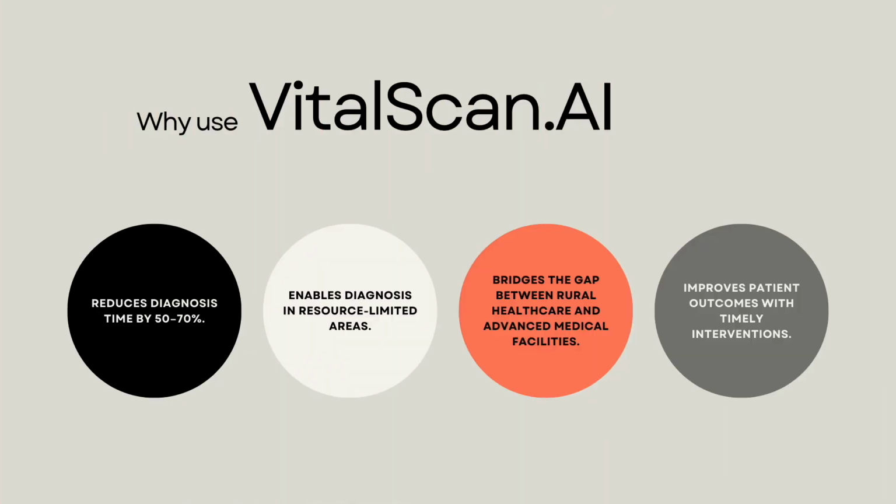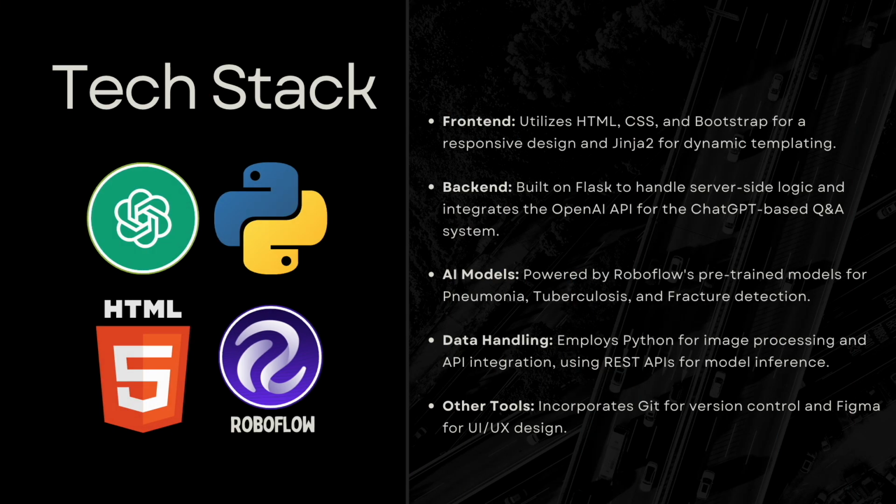So, why should you use VitalScans? That's because it reduces diagnosis time by 50 to 70%. It makes advanced diagnosis accessible in resource limited areas. It bridges the gap between rural healthcare and cutting edge medical tools and enables timely interventions that can significantly improve patient outcomes.